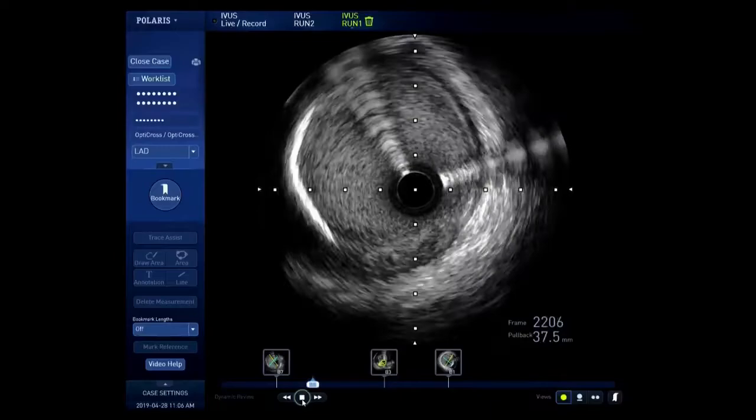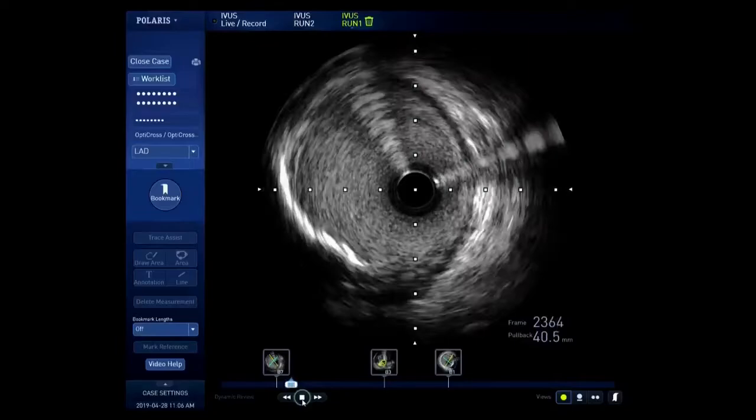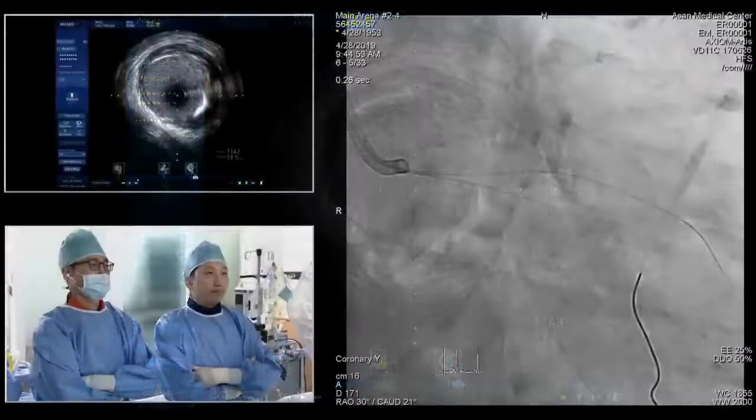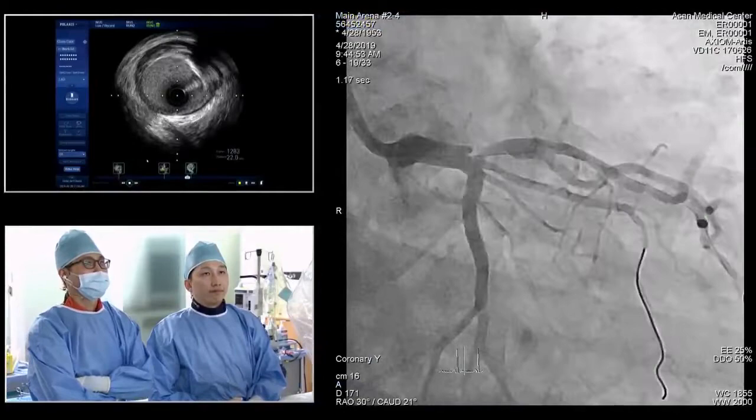So Greg, if this were a live demonstration course in Japan, you know what they would do? What? They would do DCA of the distal left main, followed by a drug-coated balloon. Yeah, that's what I was thinking. I mean, that's a perfect case for DCA in Japan. Since there are no Japanese on the panel, I'll pretend I'm Japanese and say, why not do DCA followed by a drug-coated balloon?